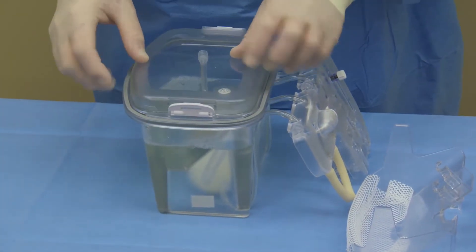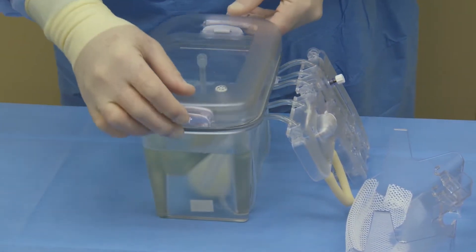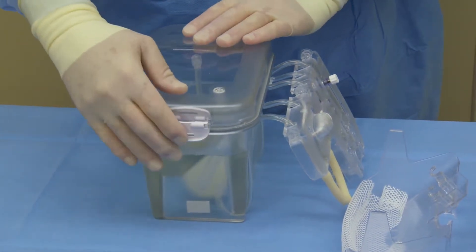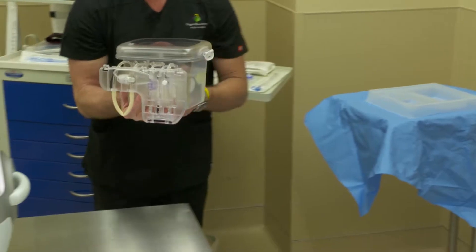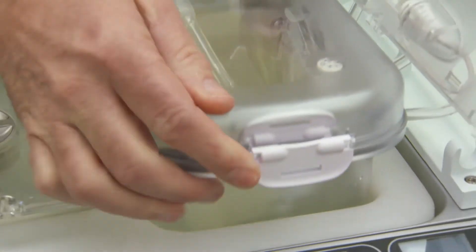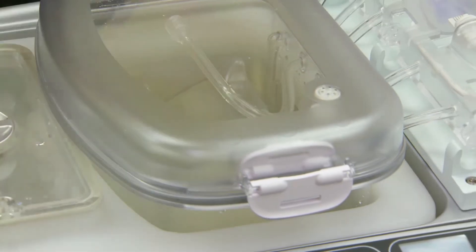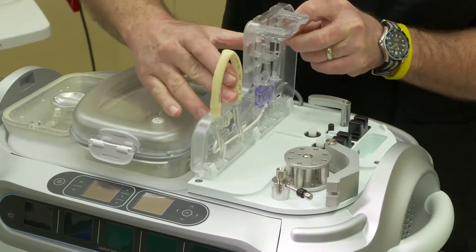Inner and outer lids are then replaced on the Lifeport Kidney Transporter perfusion circuit. The circuit is then handed off of the sterile field to a non-sterile person for finalization of setup. The perfusion circuit is placed into the Lifeport Kidney Transporter ice container. At a 90-degree angle, insert the tube frame into the U-clamps.